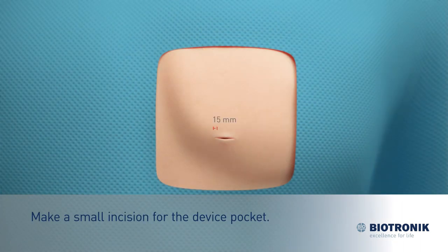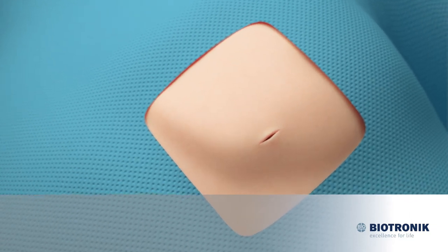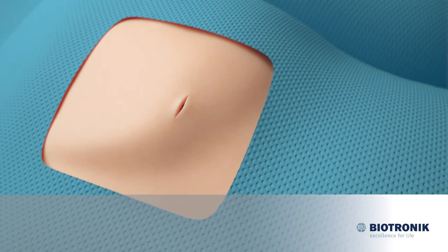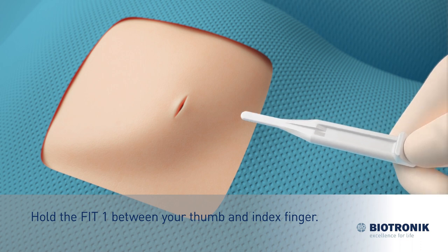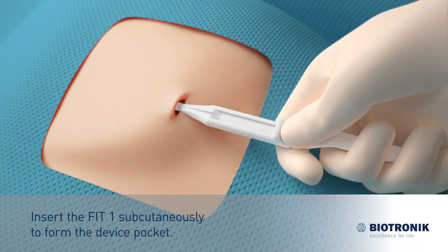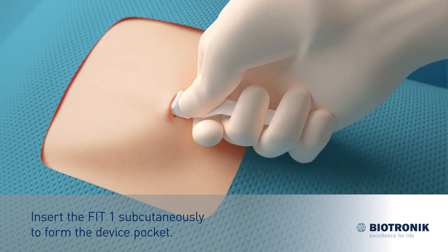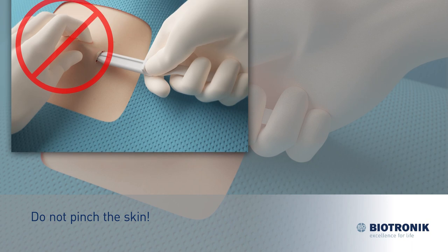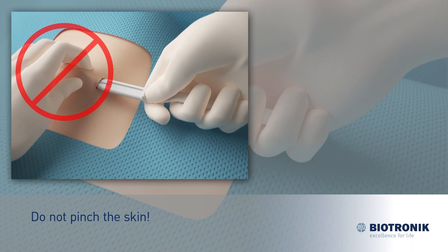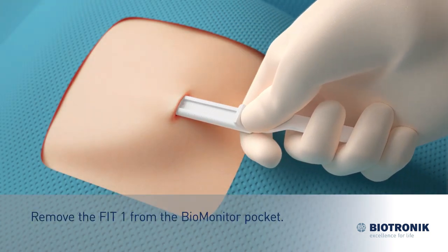Make a small incision for the device pocket. Hold the FIT1 between your thumb and index finger. Insert the FIT1 subcutaneously to form the device pocket. Do not pinch the skin. Remove the FIT1 from the Biomonitor pocket.